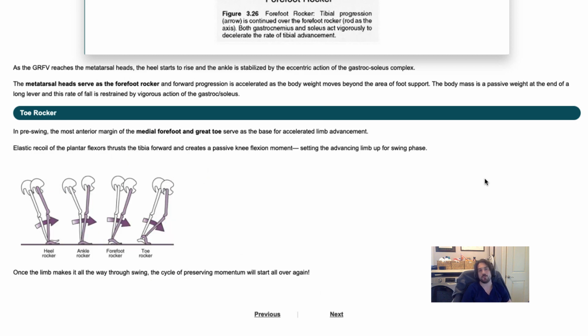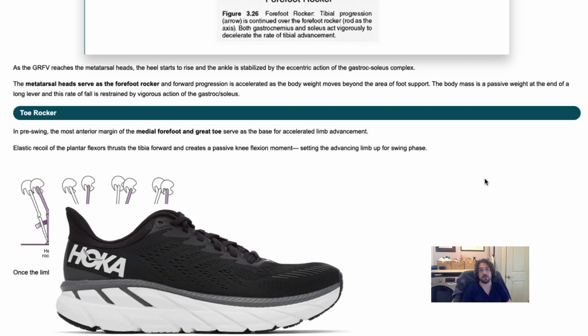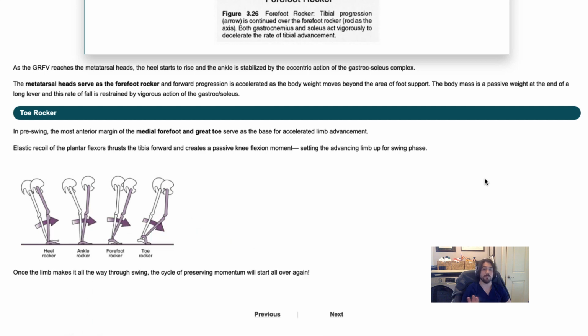So you may be able to ask an orthotist to shave down or thin out the foot plate. You'll want to be careful with this. If the person has a significant amount of spasticity, then you might not want them to get all of that toe extension. You might be setting off something that's going to create some other issues in their gait, potentially some skin breakdown if you are setting off their spasticity. So just something to be careful about there. The other thing that works fairly well is, again, the rocker bottom shoe for continuing to gain that momentum progressing forward.